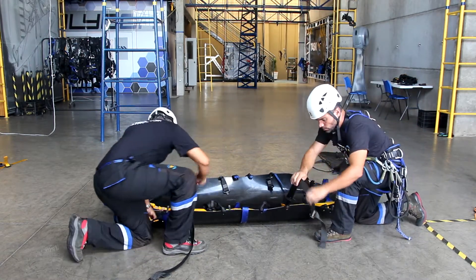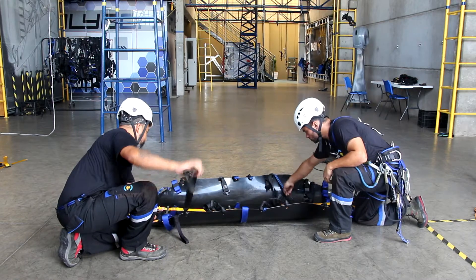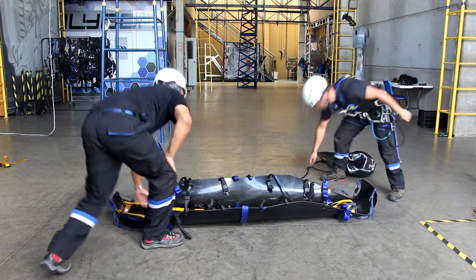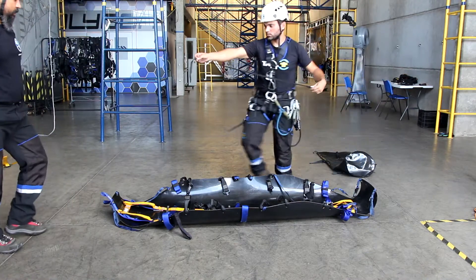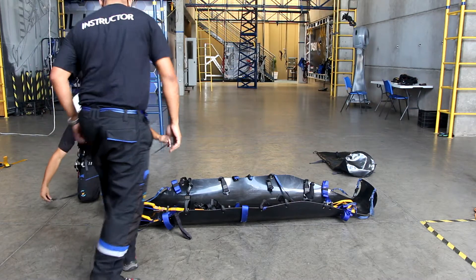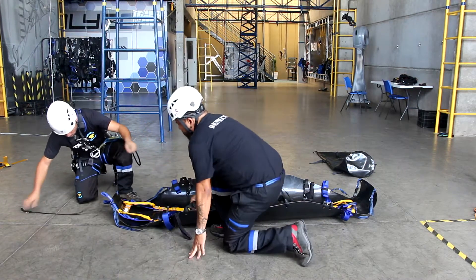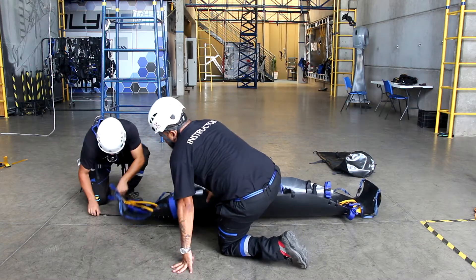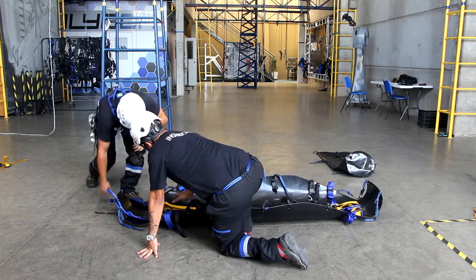Only the blue straps on the top near the head position can be stretched out of the stretcher. Put the small black strap for packing the stretcher under the sheet. This will help to keep the stretcher well-tightened.